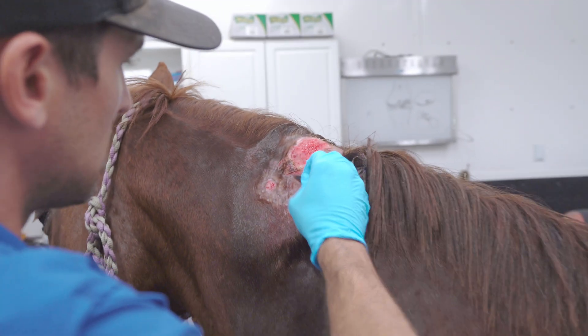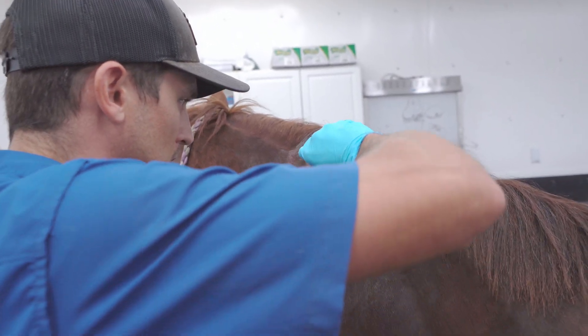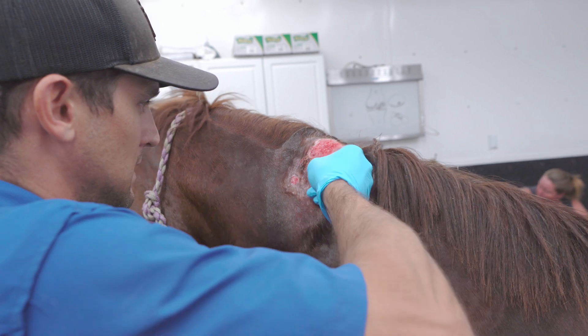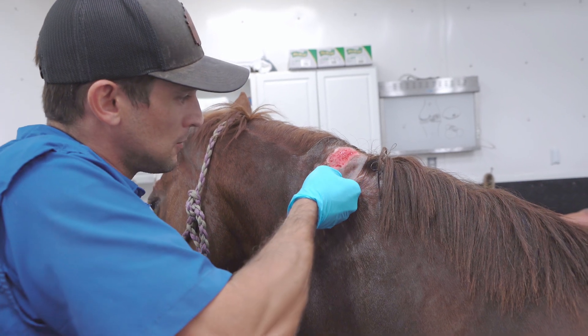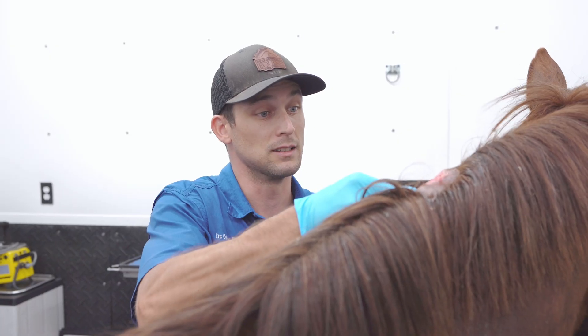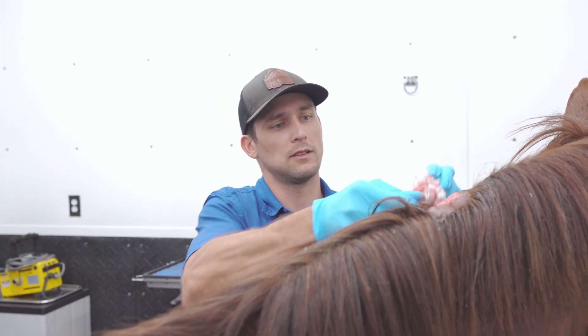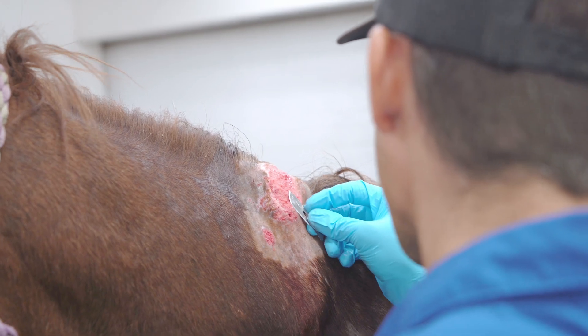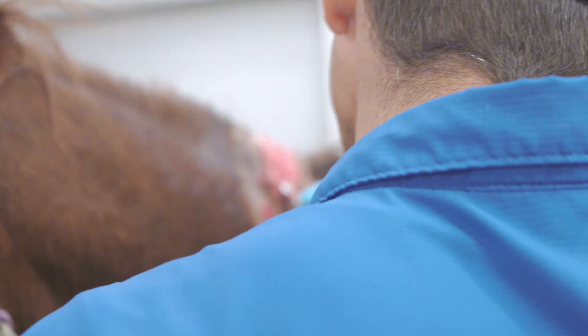While those things are in there, this wound is not going to heal well. We want to get all that nasty dead inflammatory tissue out of there to promote better healing. If we don't get this stuff out, it's not going to heal — it's going to continue getting worse. Sometimes it'll look like they're healing and kind of skin over, only to have these little spots erupt again. You've got to get this stuff out if you want resolution. Taking this surface layer off also reveals the little ones hiding underneath.